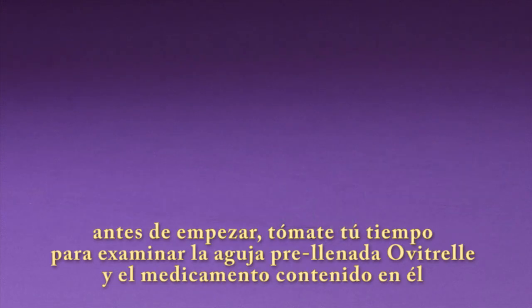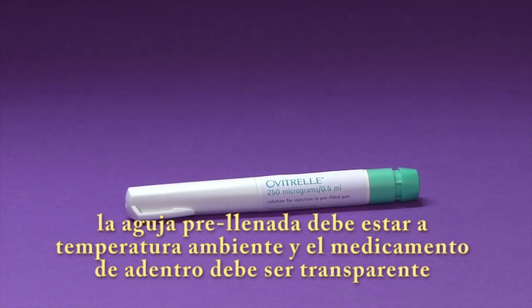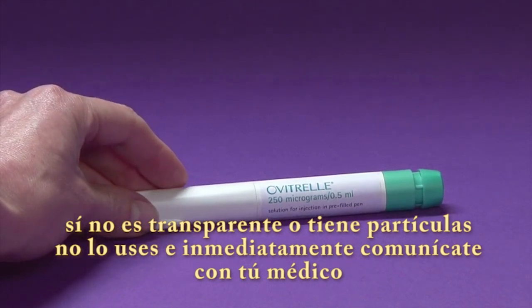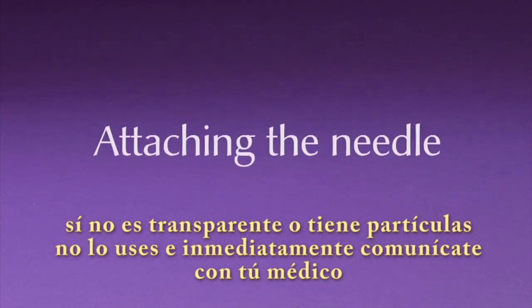Before you begin, take a moment to examine the pen and the medication. The pen must be at room temperature, and the medication in the pen should be clear. If it is not clear, or if the medication contains particles, do not use it. Instead, call your doctor, nurse, or pharmacist.